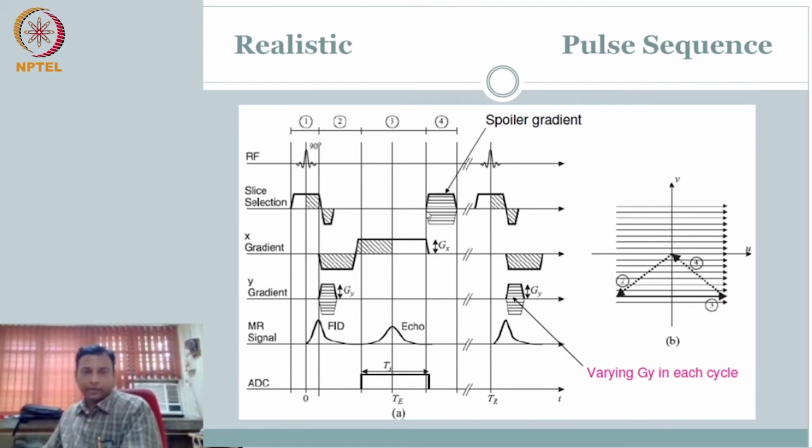This is a new guy. So this is for one sequence, and you repeat the sequence multiple times. We have put a breaker here in the time axis and said the next repeat of the sequence starts. So you are repeating this. We have incorporated repetition also in our pulse sequence diagram.